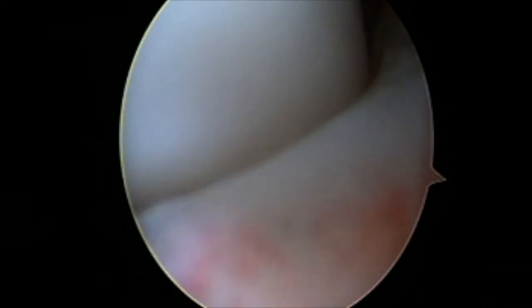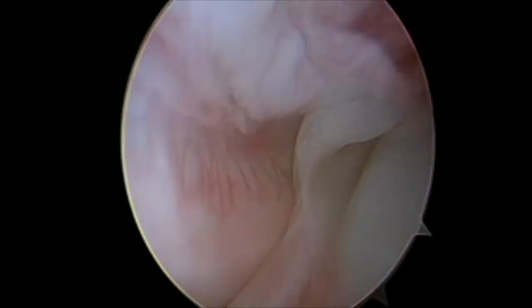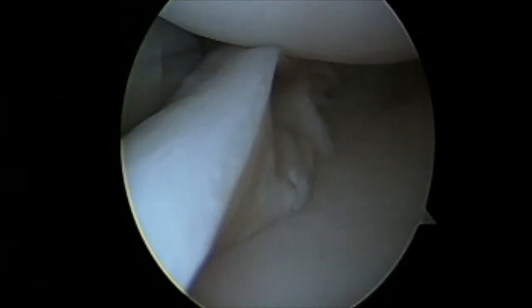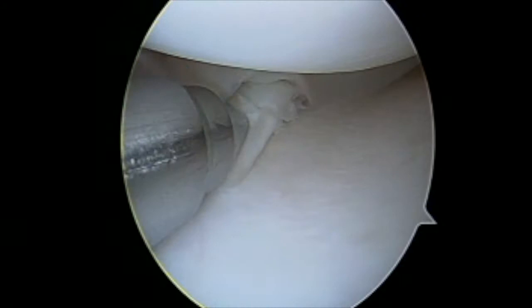Here I am looking through the anterior lateral portal. You can see a flipped bucket handle into the notch. I am inspecting it and then using the arthroscopic trocar to reduce the tear.